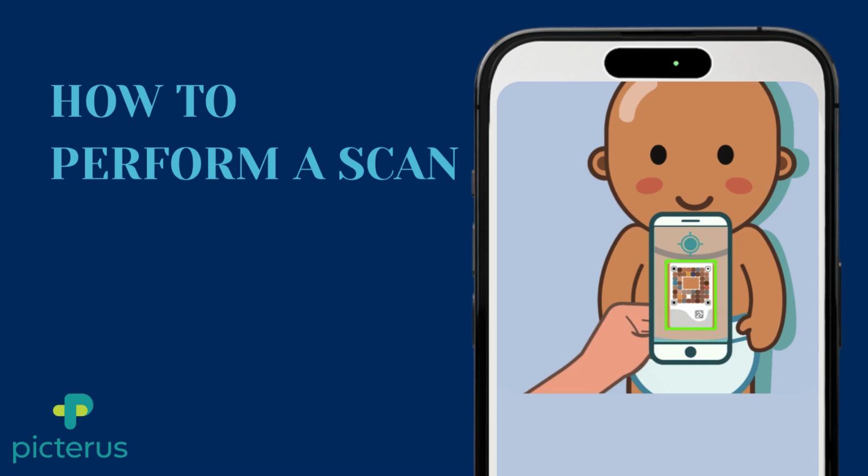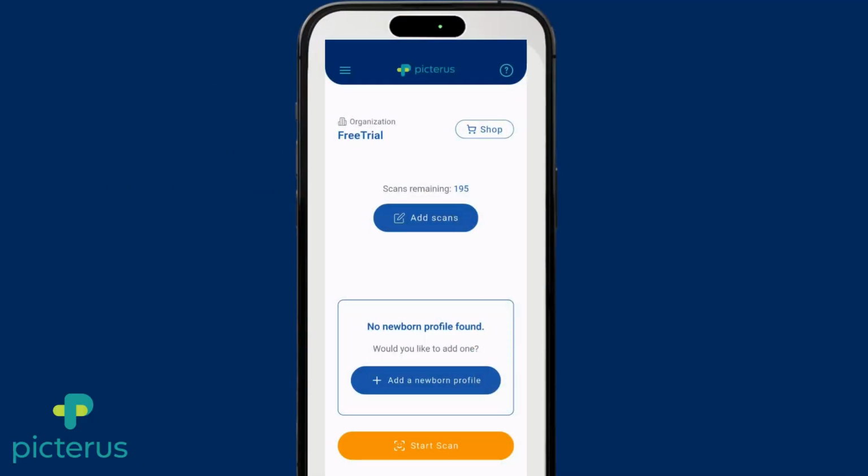Let's see how to perform a scan using Picterus Jaundice Pro. We can see I have scans available, so now I need to make a newborn profile. Press the button on the home screen to add a newborn profile. You can also access this from the app menu.